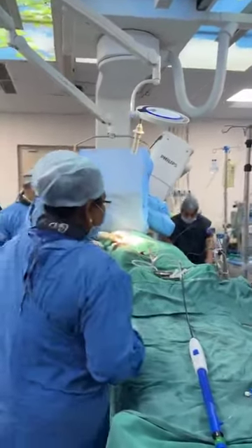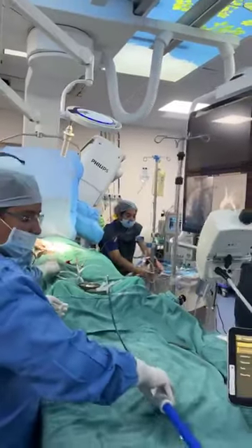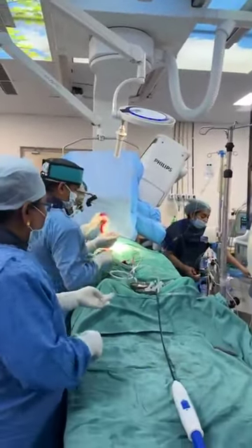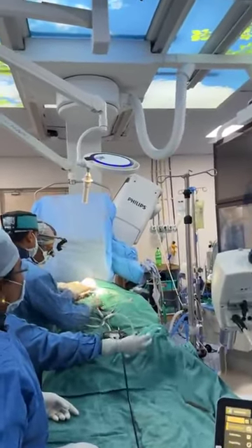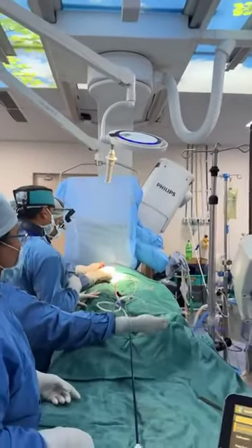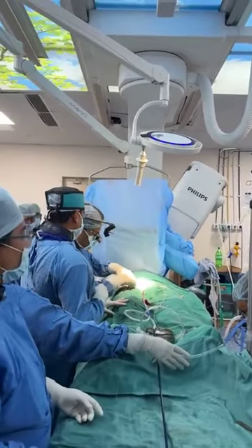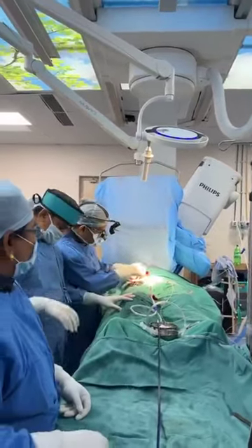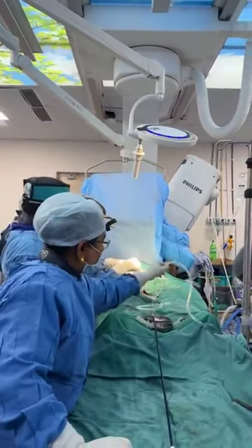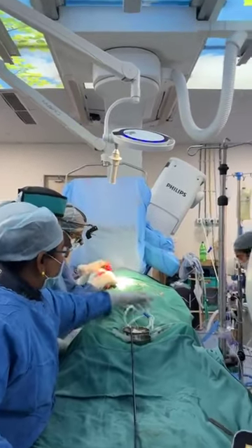Okay, bhai? Yeah. Can we take out the seat? Wait, let me have, if you have a clamp, I need a suction. It is not working. Where is it? Yeah, they are connecting it. Connecting. Okay.